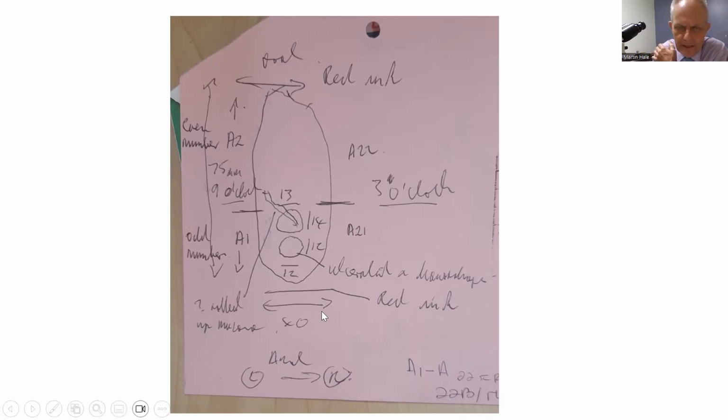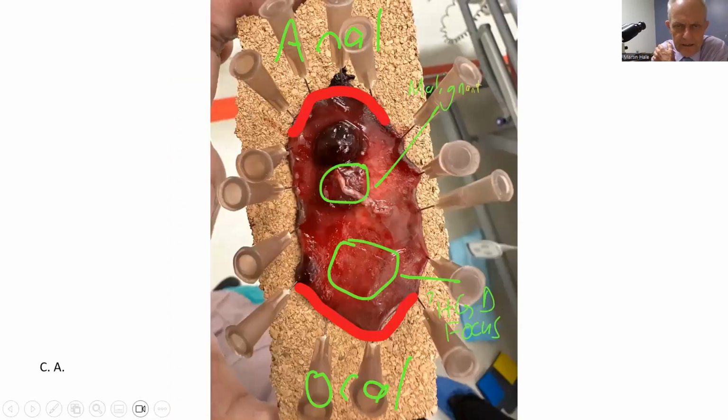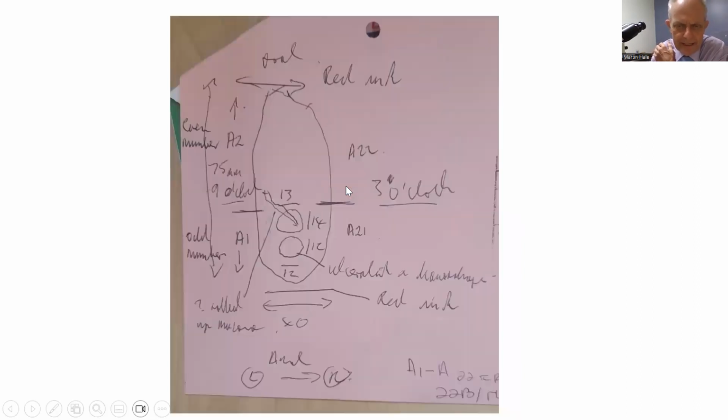So if you look at this here, the anal end, these two nodules, you see that? And if we go back to that, those are those two nodules there. Notice, if I go through my scroll, I've got here the measurement, which is 75 millimeters. That's 75 from there to there, and then the width is 40 millimeters.